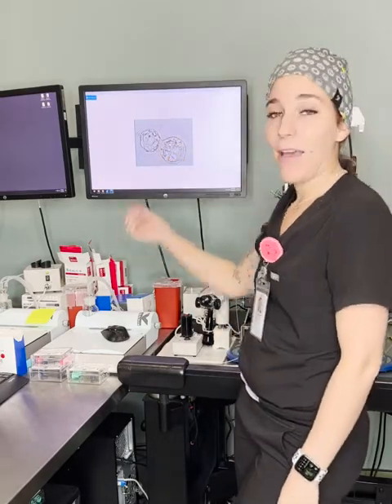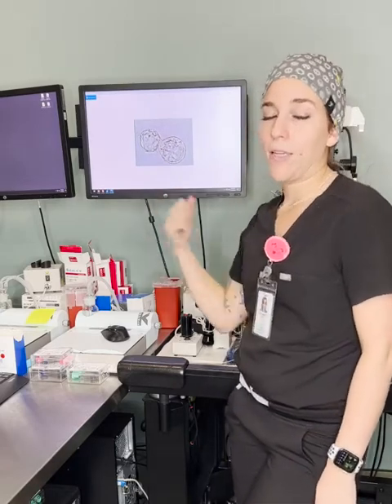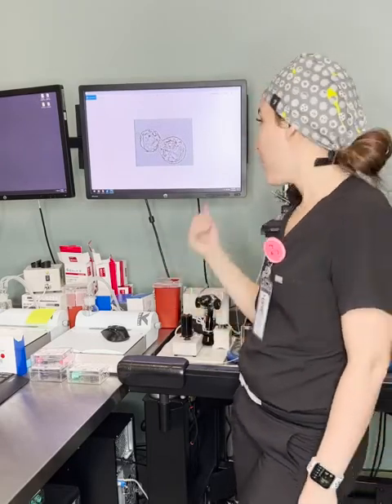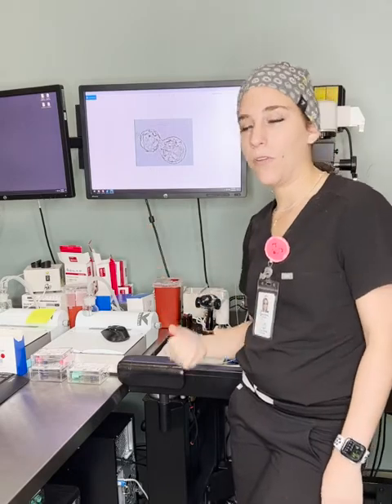So by the time those 2 hours were up, as you can see, the cavity is completely filled and the hatched out part of the embryo has already re-expanded. So just try to keep that in mind when you're worrying about assisted hatching and the damage it does on the embryo. As you can see, the embryo is beautiful. This embryo actually did implant and cause a healthy baby. It did result in a healthy baby. Just wanted to explain why they look so different and the reasons behind why we do assisted hatching.